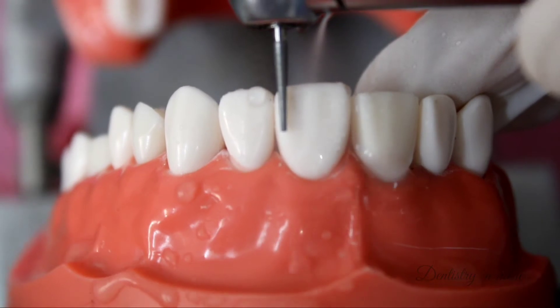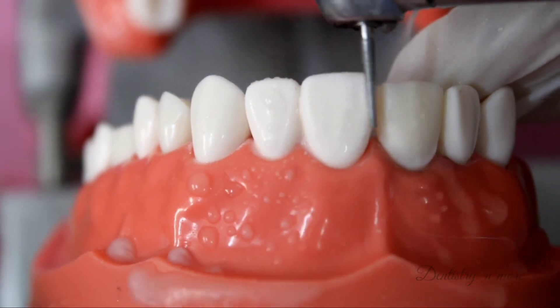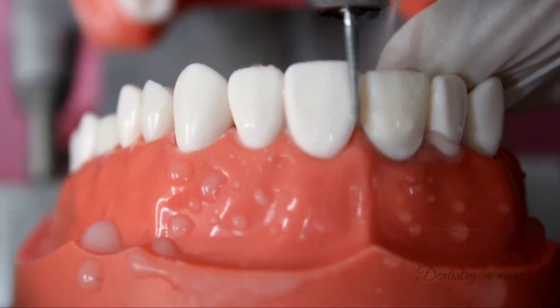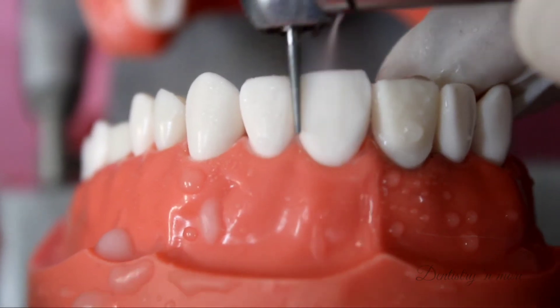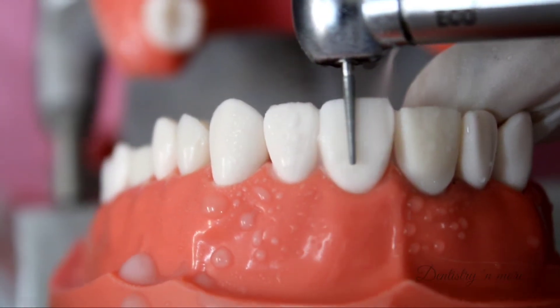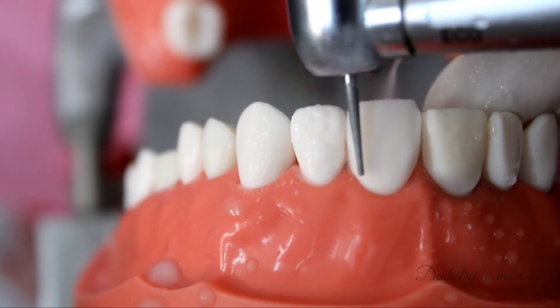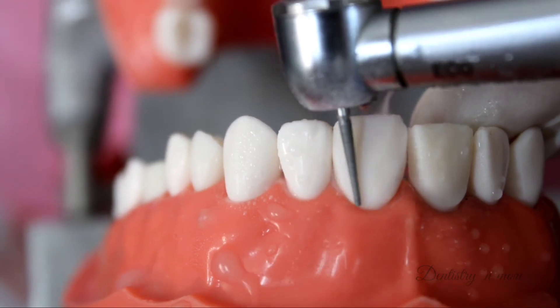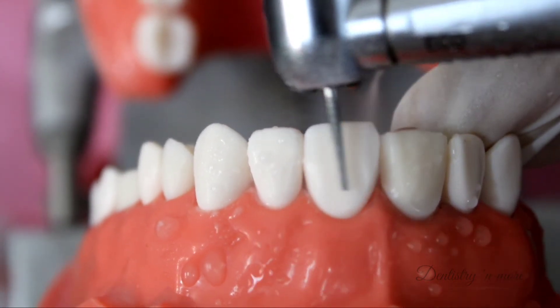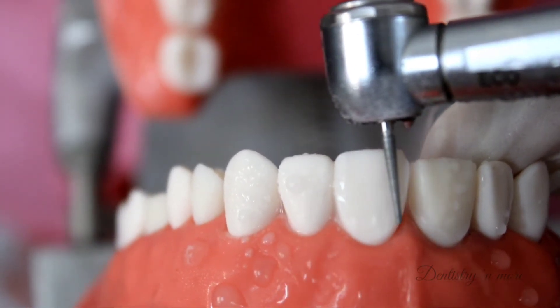Starting with the labial reduction: the labial reduction is done in two planes — the cervical one-third and the incisal two-thirds. The anatomy of the tooth dictates a two-plane reduction. The cervical one-third is parallel to the long axis of the tooth and we provide a shoulder margin. I have not placed depth cuts to begin my preparation — I personally feel that depth cuts affect the final finish and polish, so I don't use them.